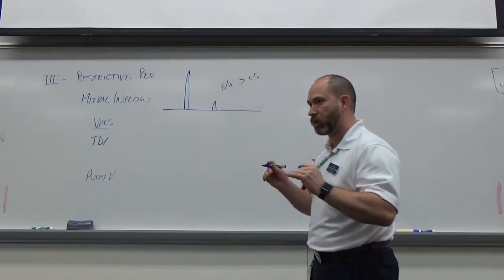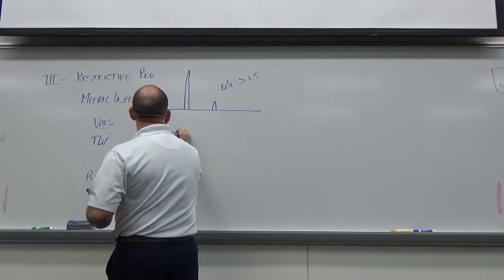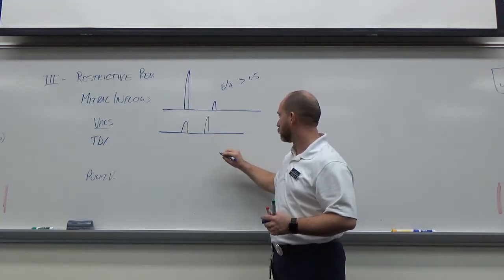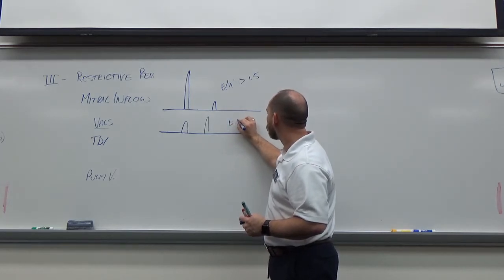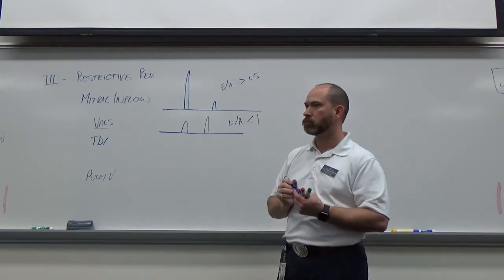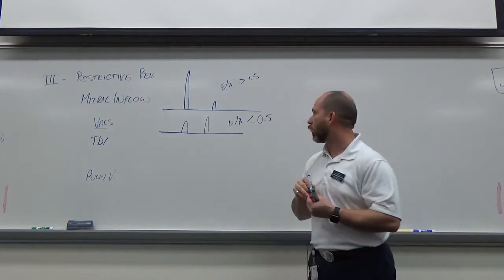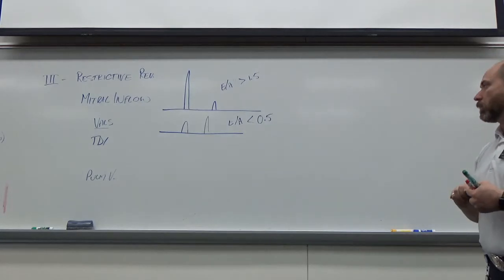Valsalva on this. Now I'm doing the same waveform with Valsalva. What do we see? The E wave's smaller. So now I get that reversed E to A relationship. It might still be spiky, but I got a reversed relationship. What's the number on that? Just less than 1? Less, 0.5? Okay, so Valsalva helps on this as well, if Valsalva is done properly. We'll always put that caveat.